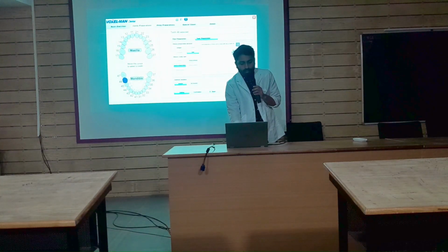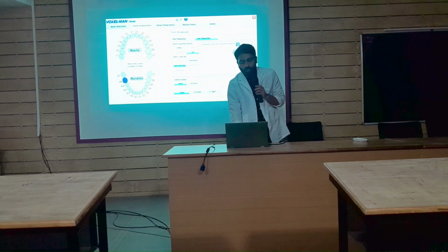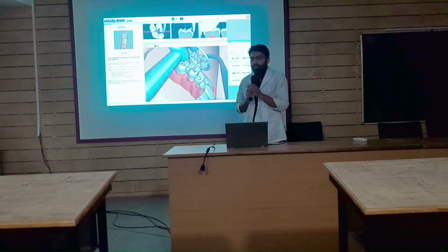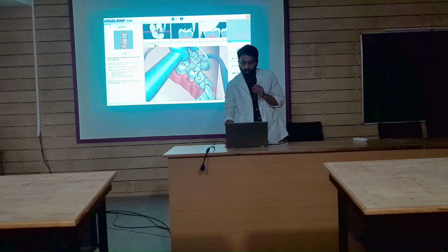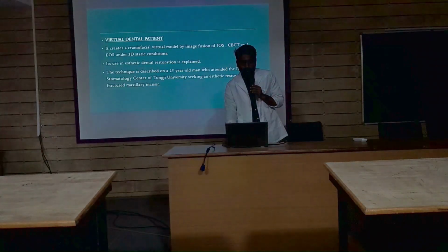So if we select a tooth, that's 4/6, if we want to prepare a cavity in 4/6, we select 4/6. Then we have all these instructions as the task preparation. What all we have to do? If you have to do a preparation for gold, then select like that. Then with the help of the haptic device, we cut the cavity like this virtually, and we can even feel all the sensations like on human teeth. And so we have virtual dental simulators.